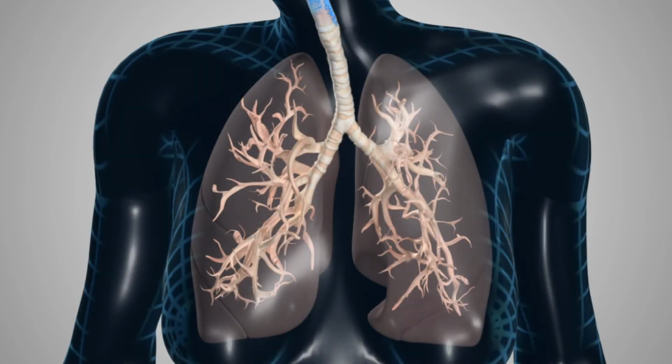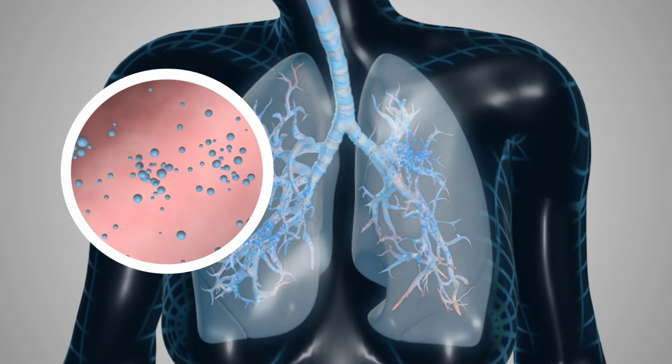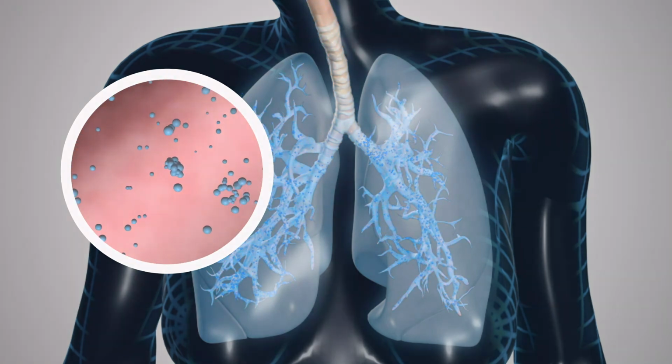A formulation with good dispersibility will break apart and deliver the drug more easily. An ideal formulation should deagglomerate and disperse powdered drug with low flow rates.